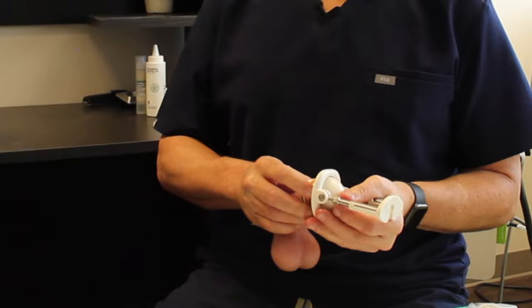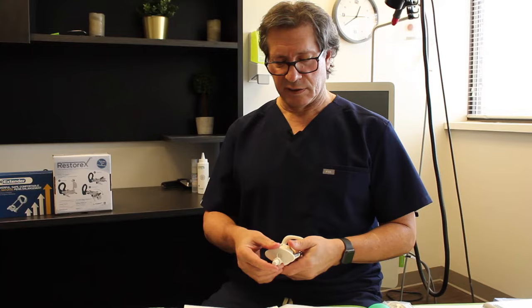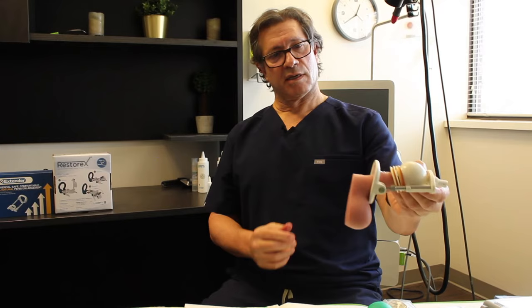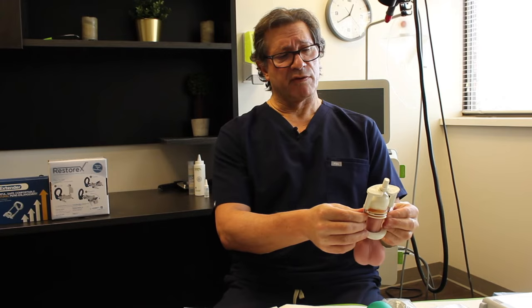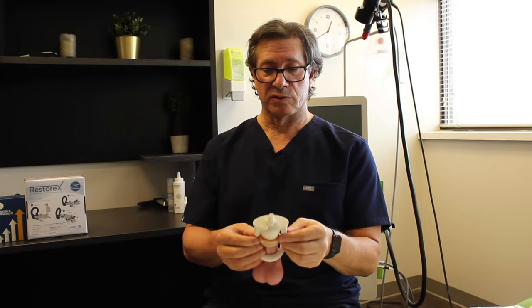Then you need to press the penis through this extension device and press up against it until you hear a click, and that's it. You can extend the device by turning these screws, or shorten it by rotating them in the other direction. If you need more length, you're going to need to attach some of the other extending bars to the device itself.